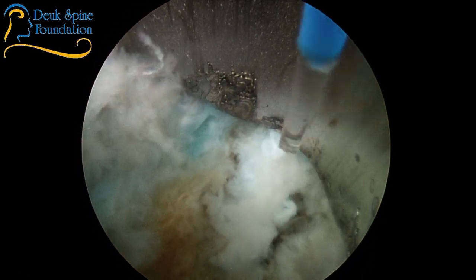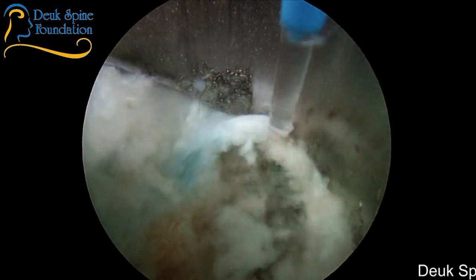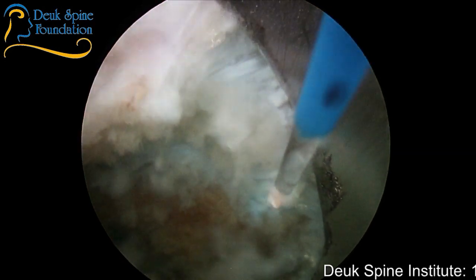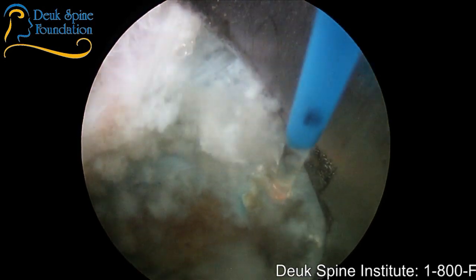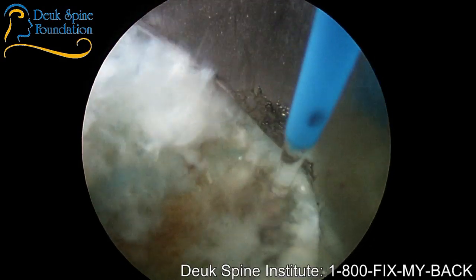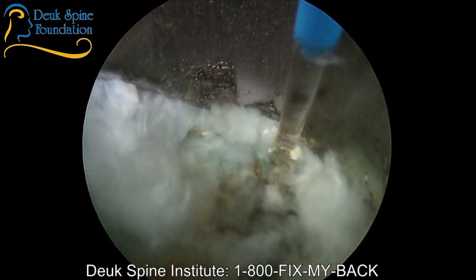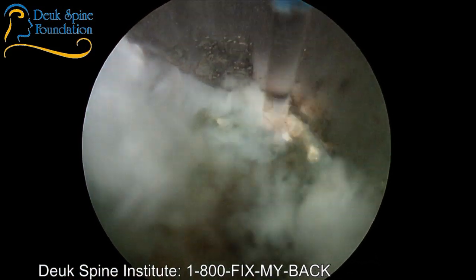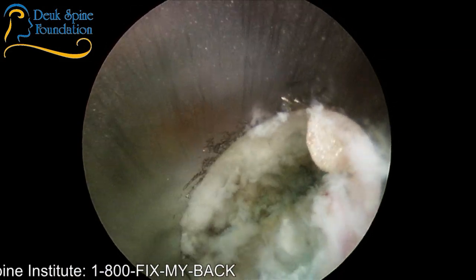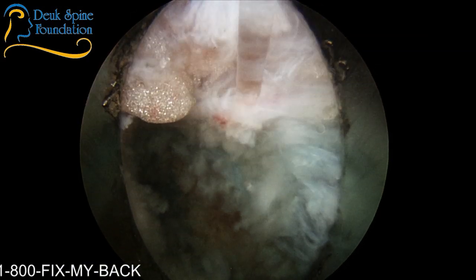All right, just about done here, looking lateral. I'm very happy. We've gotten all the herniation out. And like I said, this is going to allow the disc to heal properly now that we've removed the herniated disc. The herniation was stuck in there, like this right here, and it just would not allow the annulus to heal. It set up chronic inflammation within the annulus. That's why we've got all this granulation tissue, a little bit of pinkiness right there.